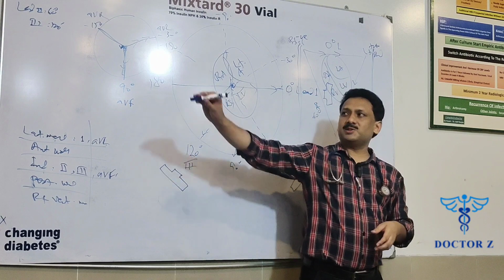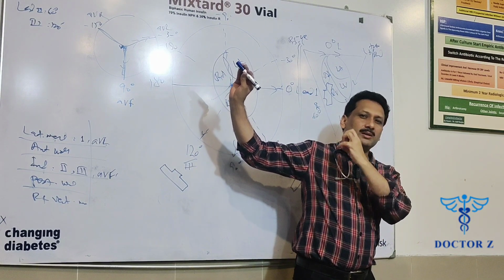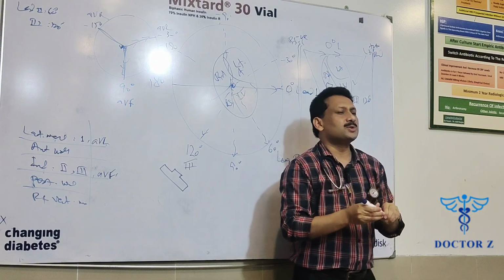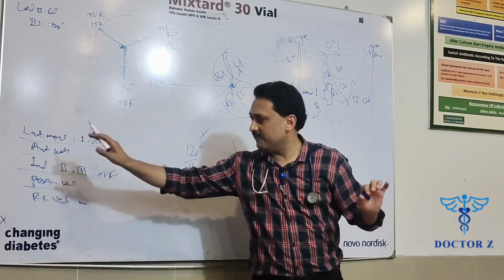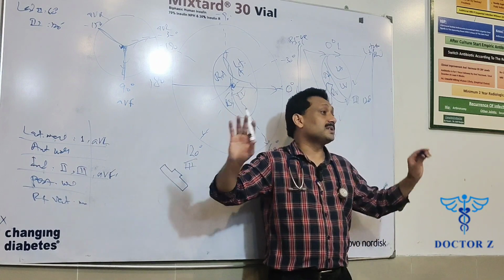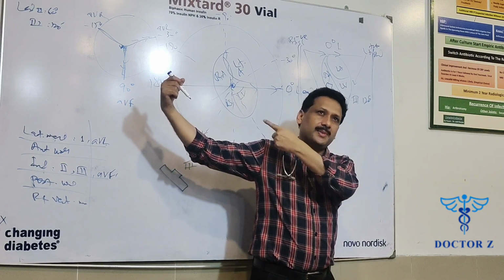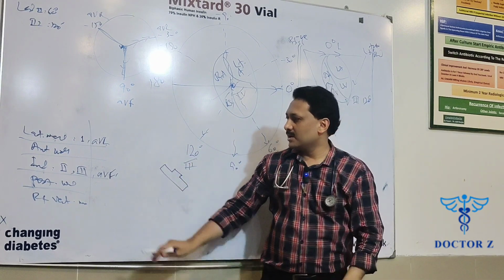Then AVR. This camera is placed here. So tell me which side it will be seeing. Right ventricular wall, upper portion. So the upper right lateral wall portion it will be seeing. As this is an isolated single lead, it's not that significant. Even if you do not mention which wall of the heart it is seeing, because we need to focus on these 5 walls only. But sometimes if someone asks you, you should have a good understanding that, sir, AVR is at minus 150 degrees in that position, so definitely it will be seeing the right ventricular upper wall portion, right?